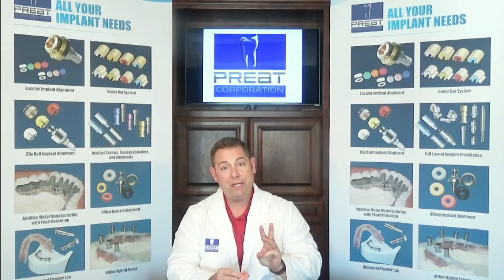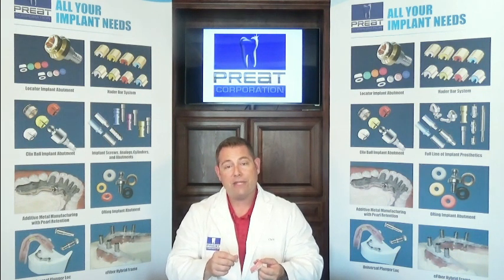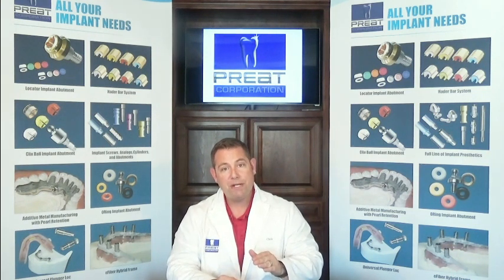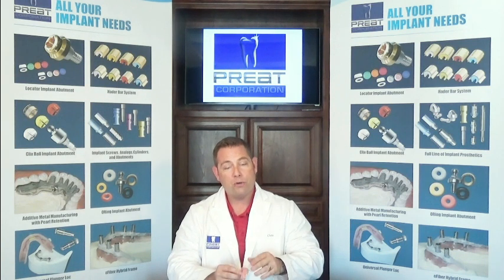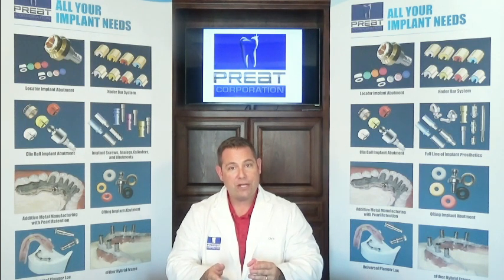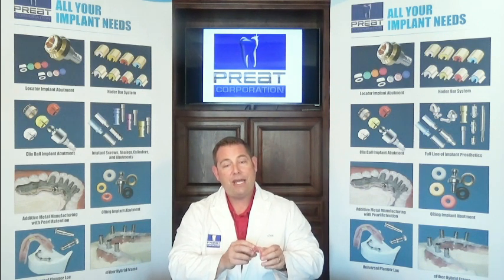Now number three, and this is big — we're not going to cut out the clips, we're not going to cut out the housings. The vertical has been established, the bite has been established. We don't want to have to re-establish this information. Leave the housings in place, leave the old clips in place — we'll replace them later. All we're going to do is block out the undercuts, scuff the saddle area of the prosthesis, and take our wash or reline impression.